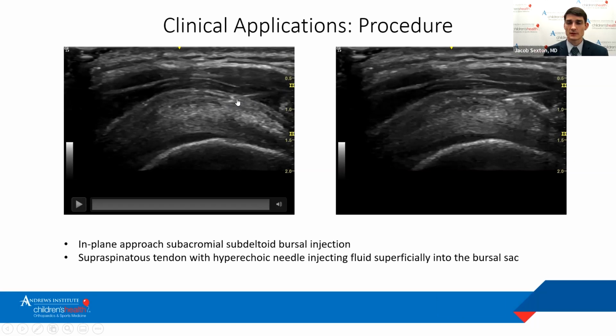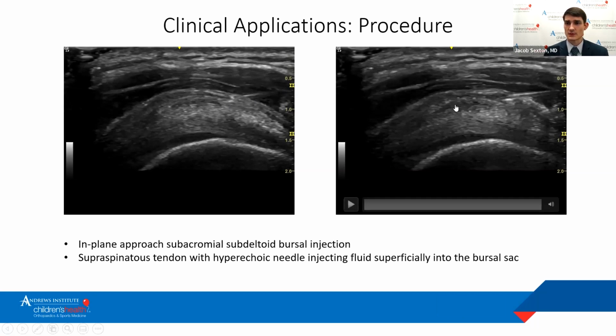So you're going to see me slowly retract the needle a little bit, and then you'll subsequently see the subacromial subdeltoid bursa kind of open up. And then this next image is a continuation of that.